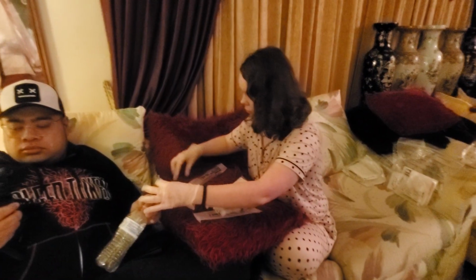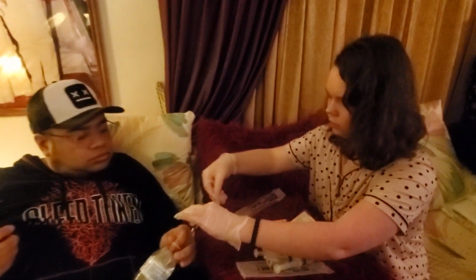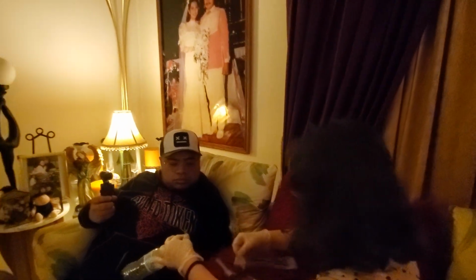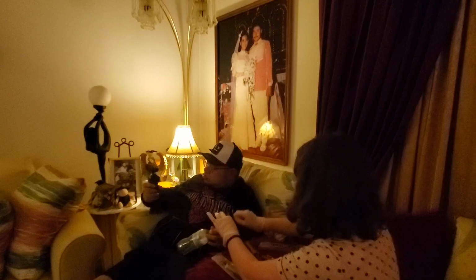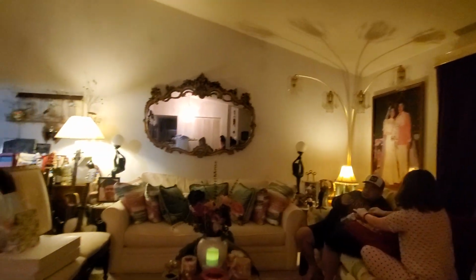Okay, now I'm going to throw this away. I'm going to grab my new cap and put it on. Well, before I put the new cap on, I should probably wipe it with the alcohol wipe. Then I'll put my new cap on. Does this actually fit on here? No, it doesn't. So pretend I put a cap on.